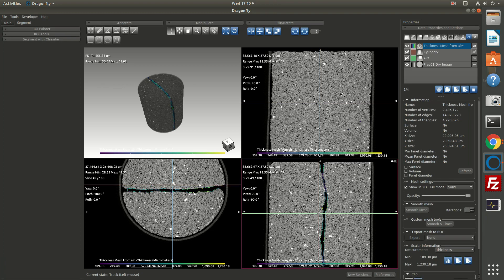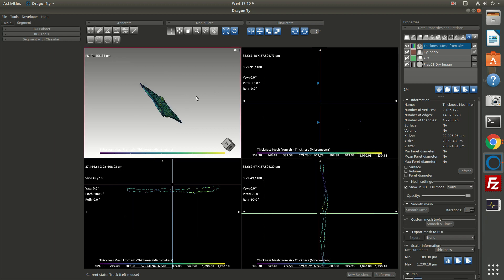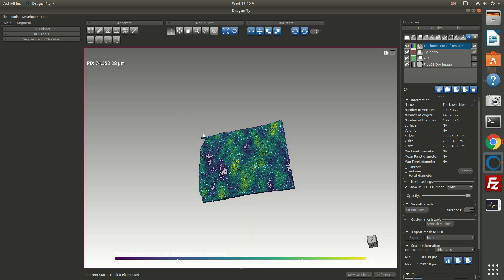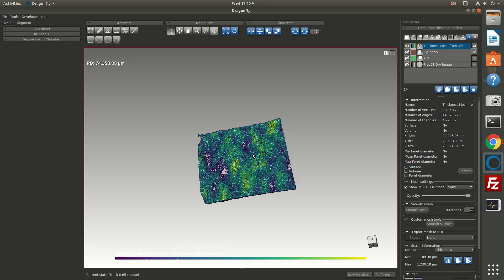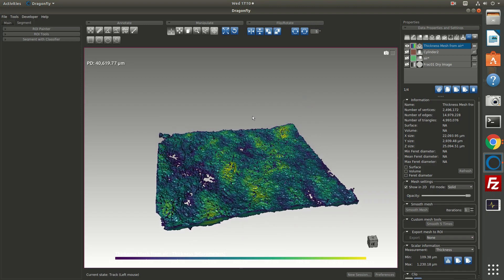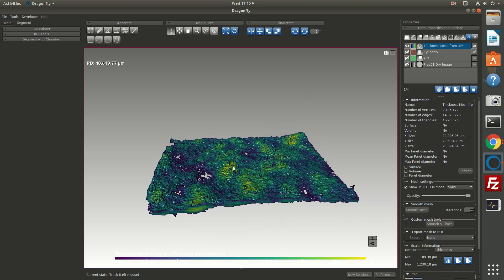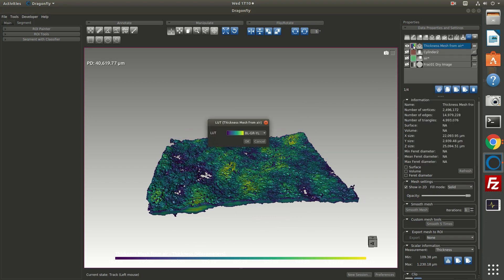Over here, I'm going to turn off the visibility of the air ROI and turn on the visibility of the thickness mesh. You can see the contour of the mesh, and you can see it in 3D here. If I turn off the visibility of my image channel, then we see the thickness mesh in 3D. I'm going to double click. So here we have the thickness mesh. So it allows us to see where the fracture aperture is greatest or smallest.